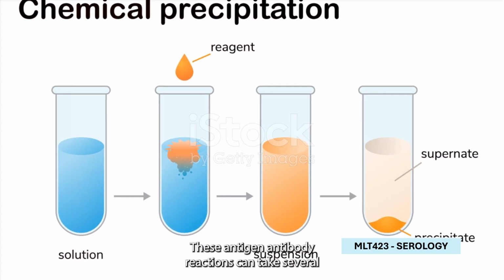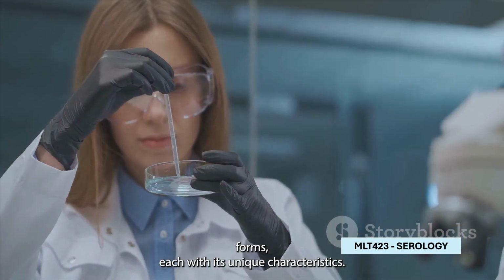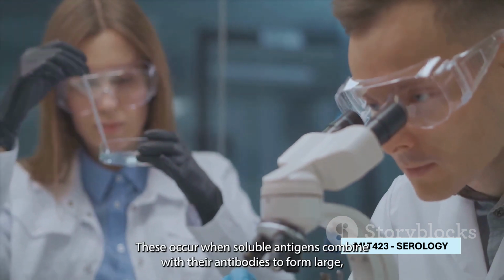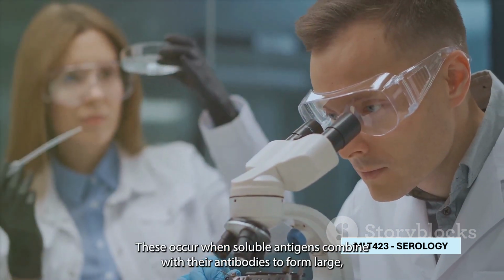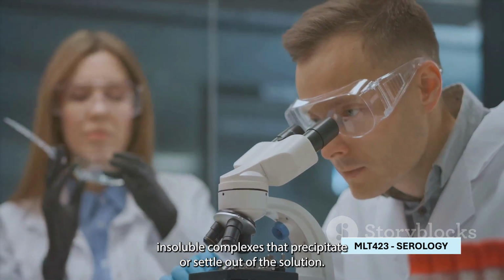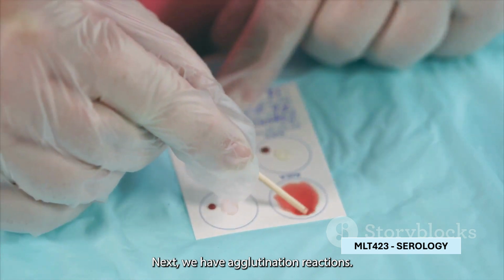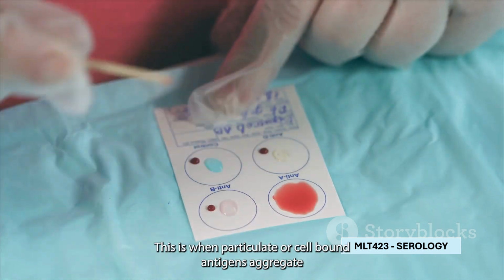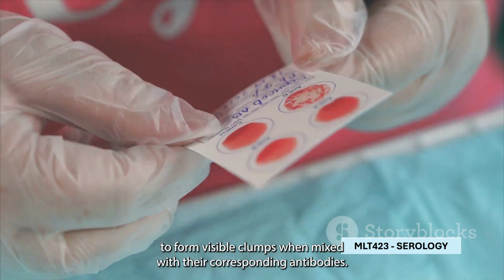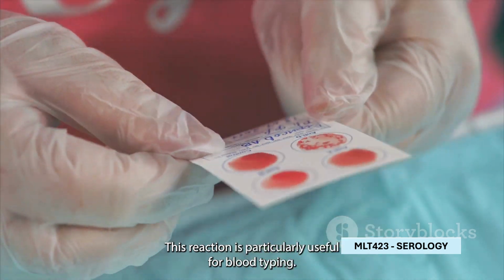These antigen-antibody reactions can take several forms, each with its unique characteristics. First up, we have precipitation reactions. These occur when soluble antigens combine with their antibodies to form large, insoluble complexes that precipitate or settle out of the solution. Next, we have agglutination reactions. This is when particulate or cell-bound antigens aggregate to form visible clumps when mixed with their corresponding antibodies. This reaction is particularly useful for blood typing.